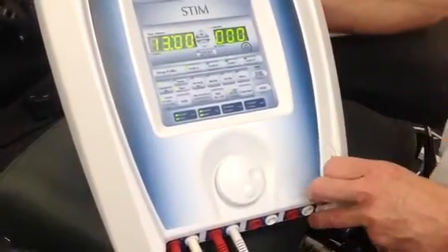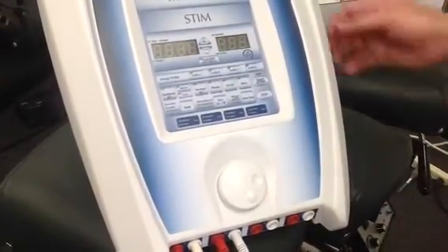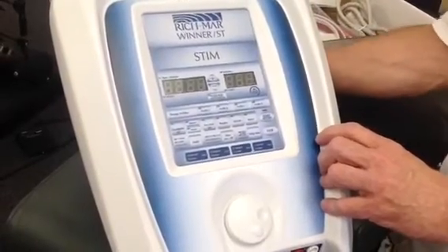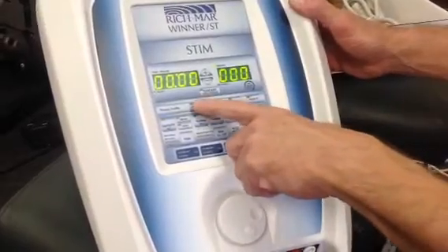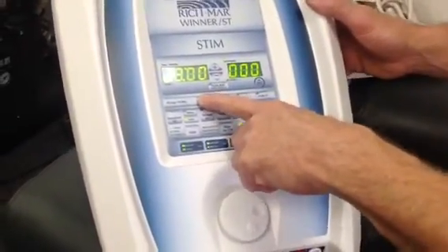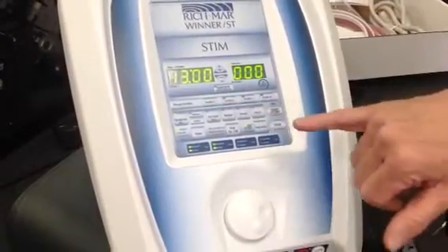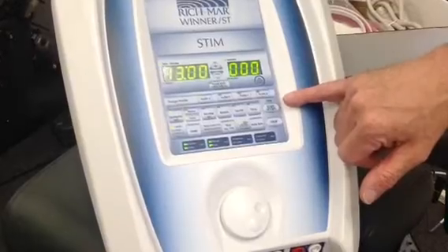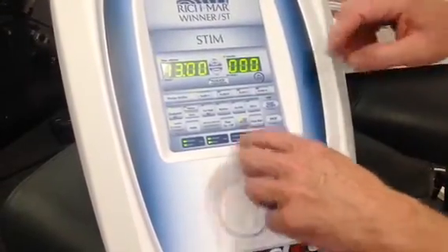What most people want to do is program it. All of this information is in the owner's manual, but when you first turn it on, you press Profile A twice. That puts it in program mode. You have Profile A, B, C, and D. Those are your 4 pre-programmed options. We've already pushed it 2 times, so we're in program mode.